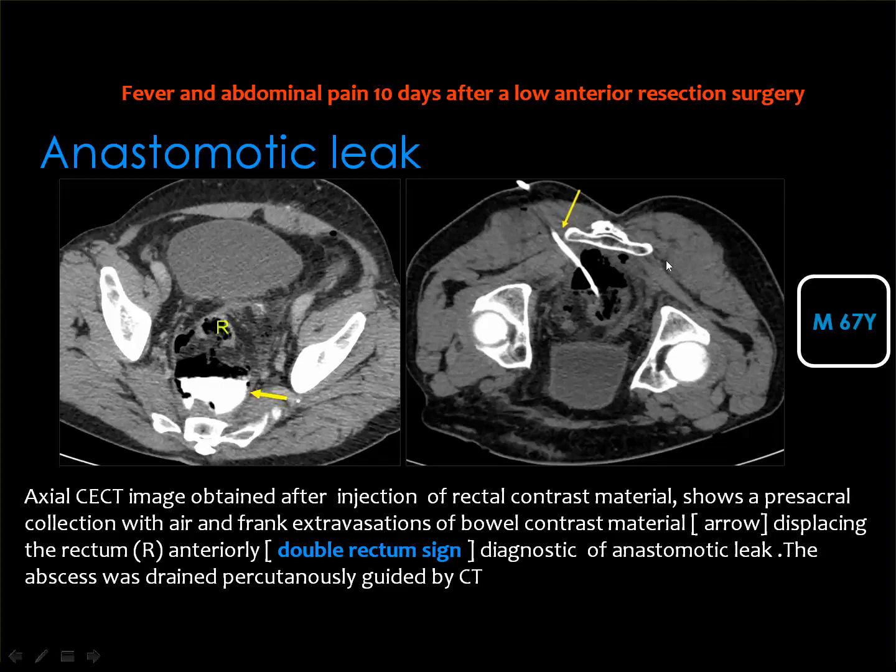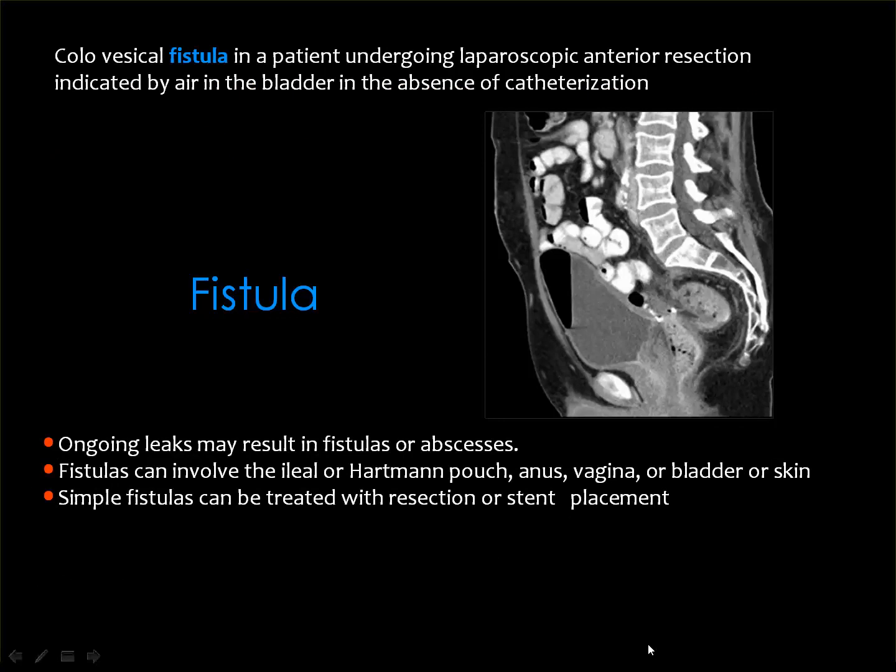And actually, CT is one of the good modalities to guide percutaneous catheter drainage of such leaks. Then fistula is also one of the complications, and you got fistula between the colon and the bladder, between the colon and the ureter, between the vagina, and so on.